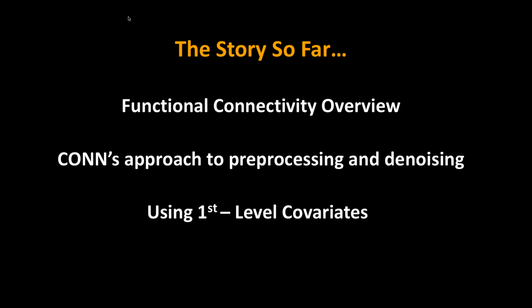So it converts these correlation values to a z-statistic at each voxel. Then within each voxel, because they're all normalized to the same space, it asks: is that value across all the subjects consistently positive, consistently negative? Is it a mixture? Does it average out to zero? What happens exactly? It's really the same thing as doing a t-test at that point.